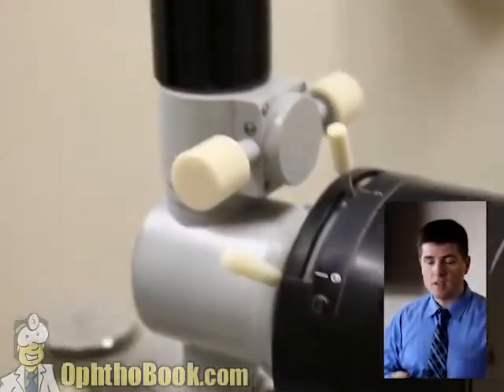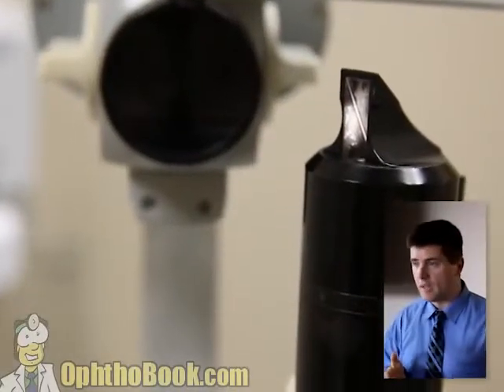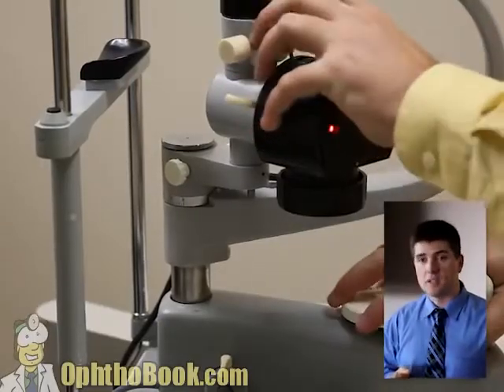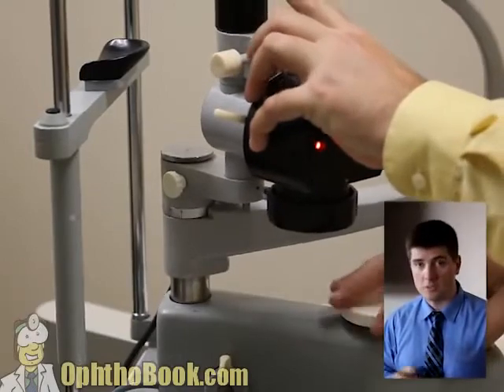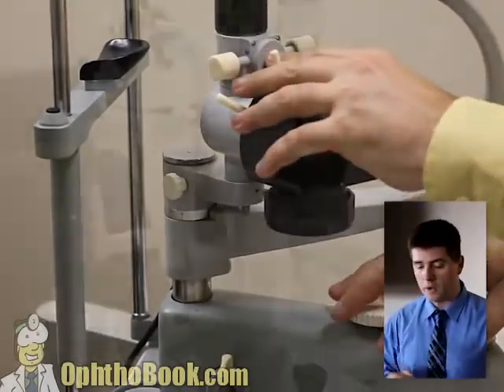This is a Zeiss. The light is down below and basically shoots through various prisms before focusing on the eye. I think this is probably an improvement in design. The only problem with this scope is it's just so hard to use. The ergonomics are just terrible unless you're a human octopus. It just doesn't work well.